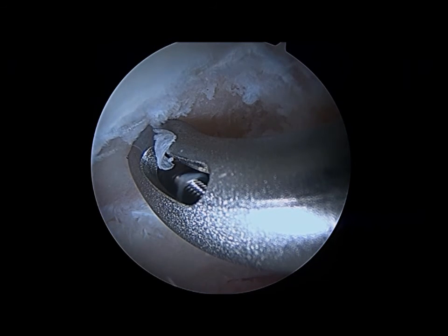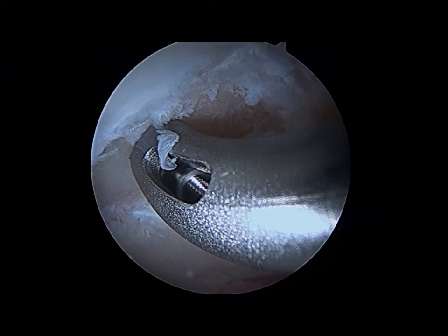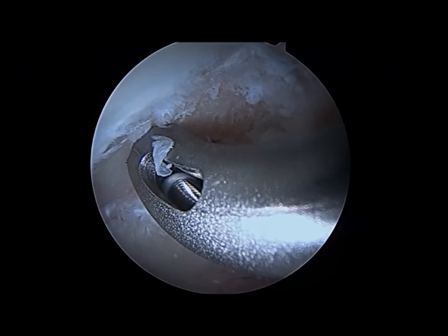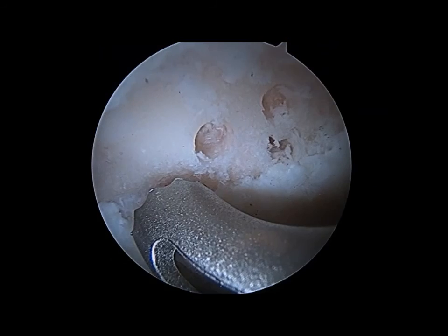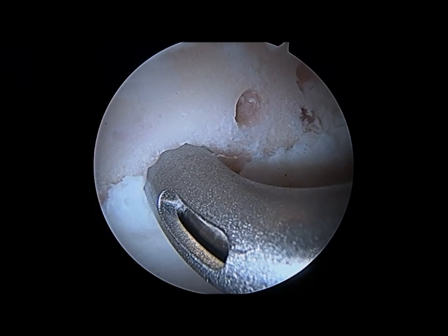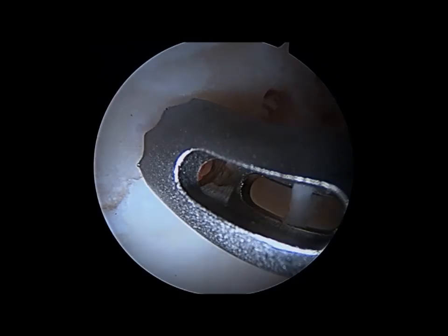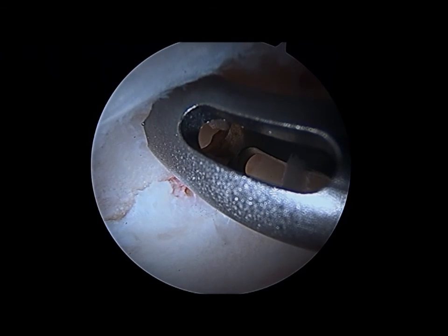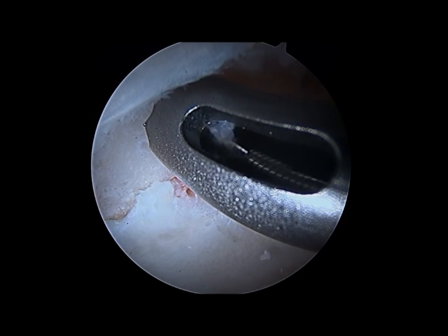After the hard stop, the drill is removed while continuing on full forward speed. Drill holes are first made around the periphery of the defect adjacent to the healthy cartilage. Next, the defect is perforated with additional holes spaced at approximately 3 to 4 millimeters from each other in order to avoid combining the holes. As the irrigation pressure is decreased, fat and blood droplets should be observed exiting the drill holes. Once the procedure is complete, the fluid is drained, and the capsule and portals are closed in standard fashion.